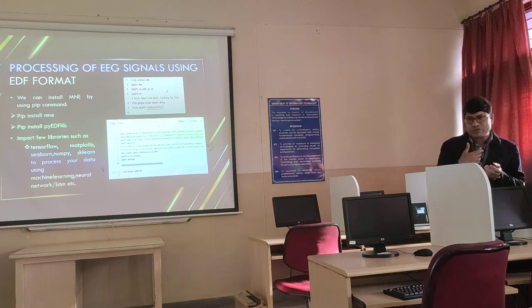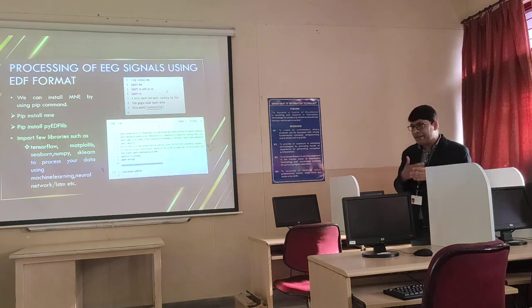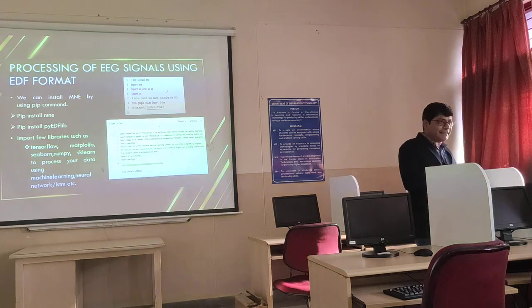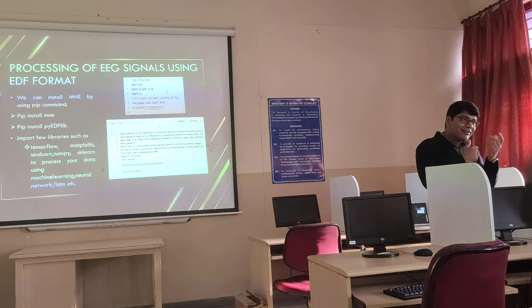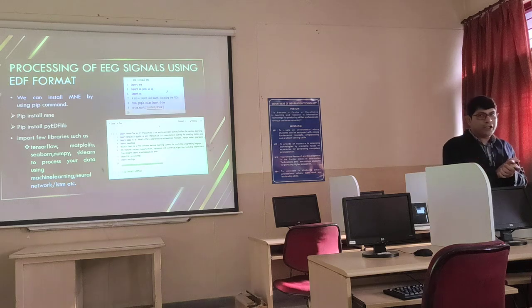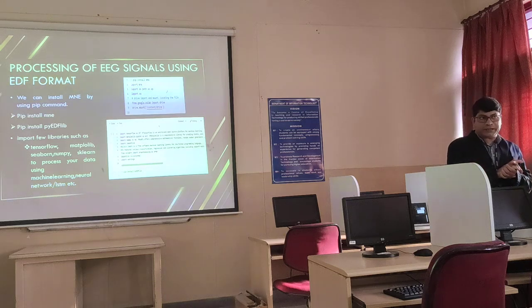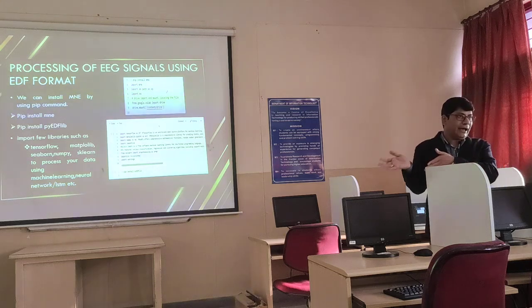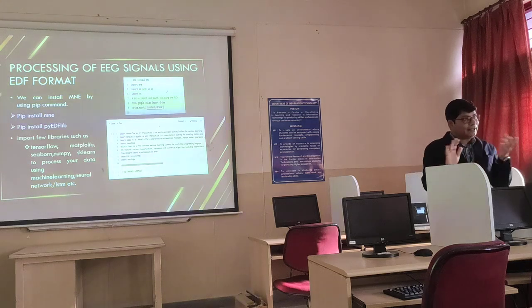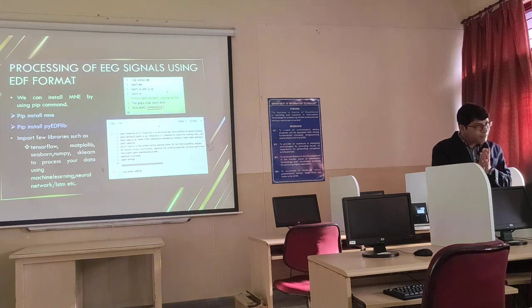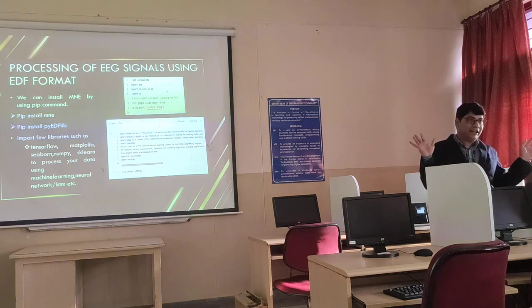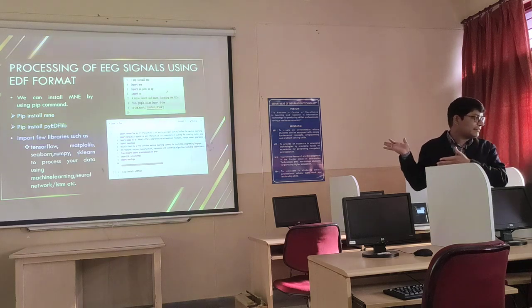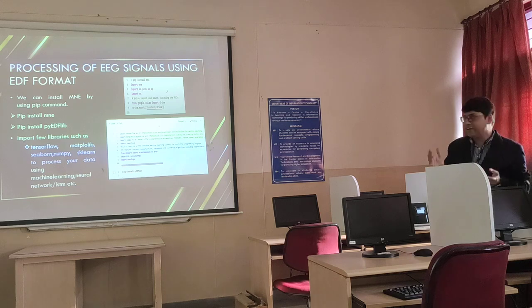The main objective is: whatever data you are reading — in EDF format, .set format, or CSV format — you try to convert it into a data frame format. After that you can apply standard machine learning techniques. We don't need to deal much with complex signal processing.